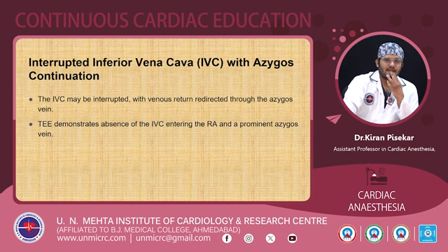The second most common is interrupted IVC with azygous continuation. The IVC can be interrupted, with venous return redirected to the azygous vein. Here a segment of the IVC between the renal vein and the hepatic vein is interrupted, and that will be drained by the azygous vein. So the azygous vein will be dilated and will be draining into the SVC in this patient, and the hepatic veins will be draining directly into the RA.